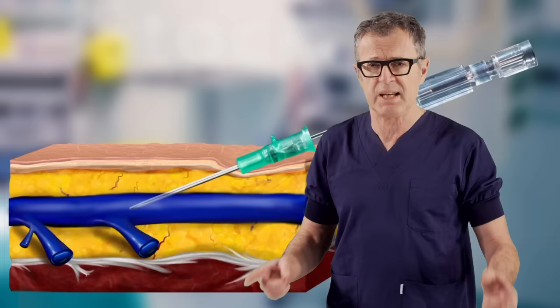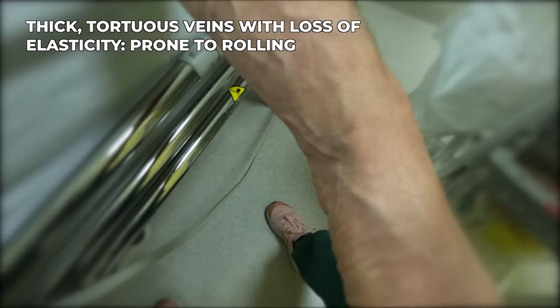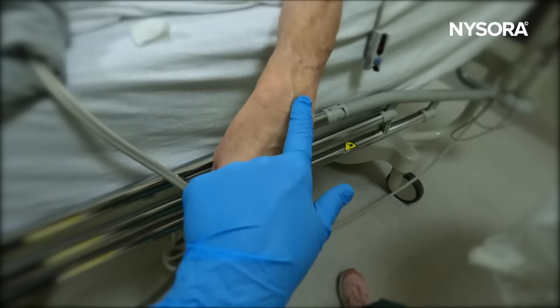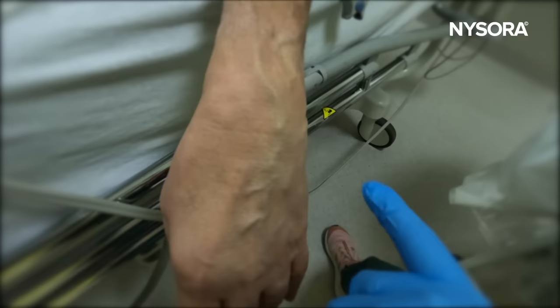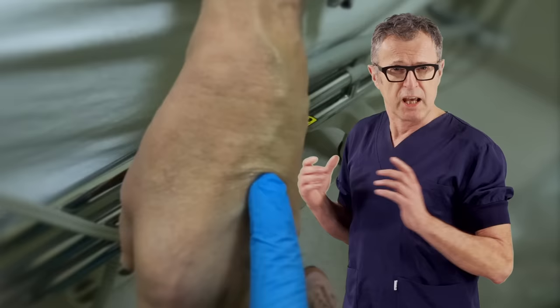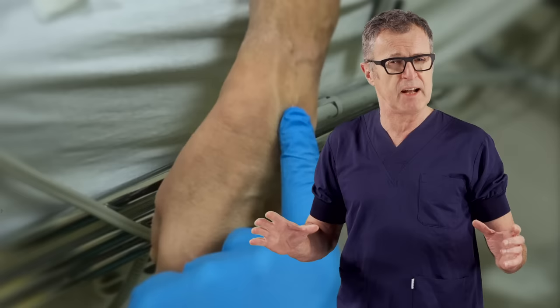However, what makes this IV access difficult is that the veins are torturous and they have thick walls with loss of tissue elasticity around them, which makes them very easy to roll. Rolling veins is the description used for veins that tend to escape the needle stick. They roll very easily when you push them, so it's extremely important to pick a point where two veins come together, as they are a bit more fixed. Many veins here are prominent, but none appear to be straight and they tend to roll easily when palpated.